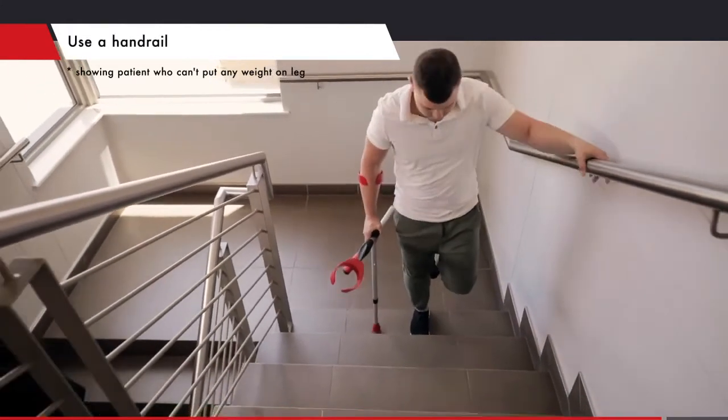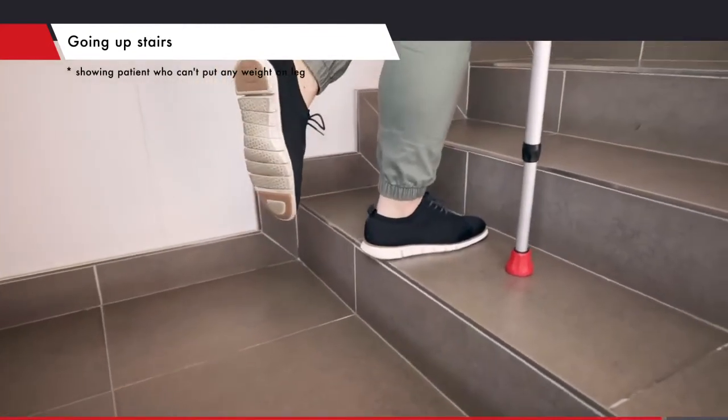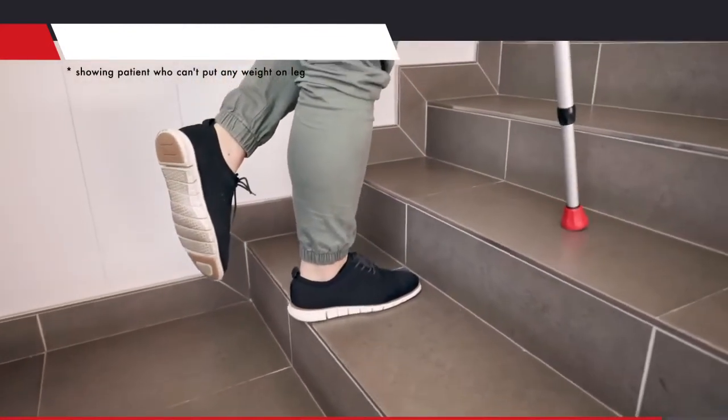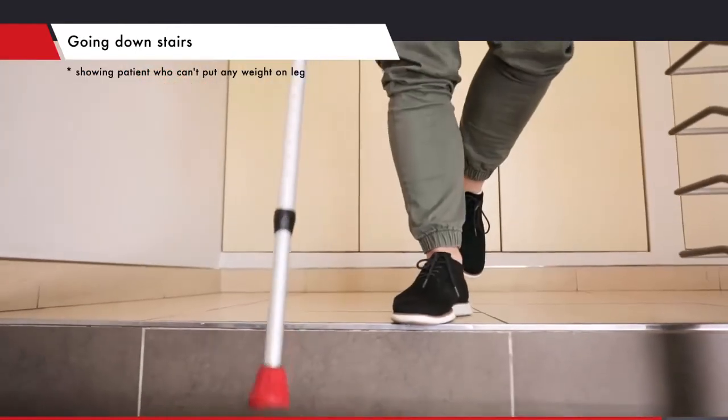When using a handrail, the patient should keep one crutch under their arm and use the handrail with the other arm for support. First place the crutch on the step above, then step up with the stronger leg without putting weight on the sore leg.